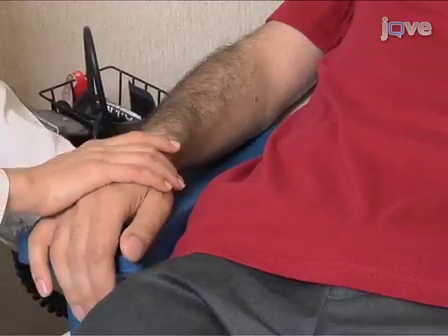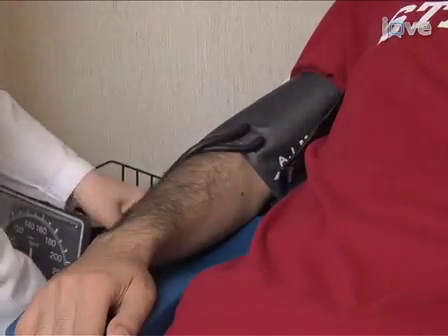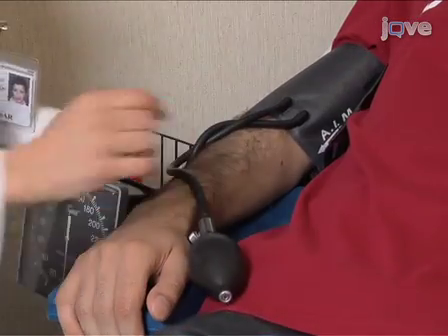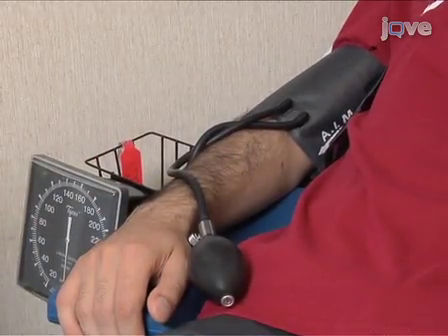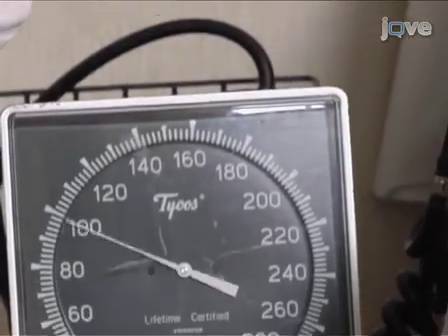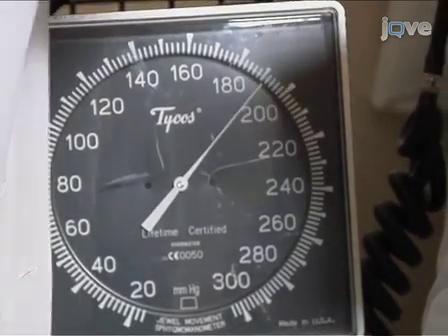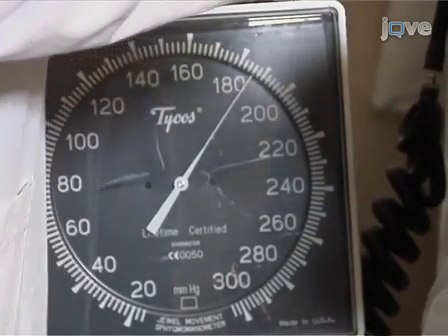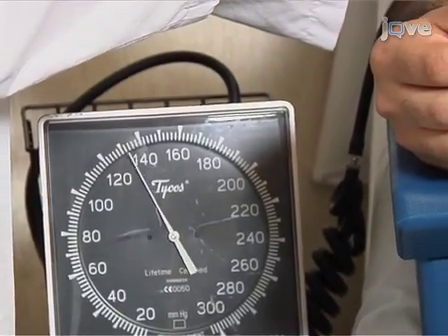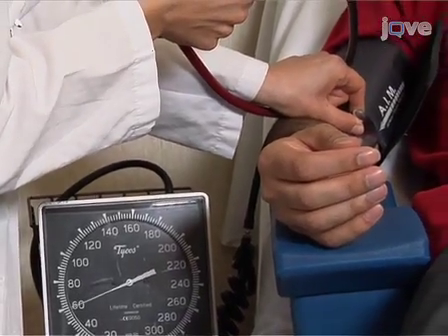Apply a blood pressure cuff to the arm and allow the arm to be supported at the patient's side. To allow the patient to reach cardiovascular steady state, they should be relaxed and comfortable in the supine position for at least 15 minutes. Measure the blood pressure in the arm that is not occluded during the Endo-PAT study. Move the cuff to the non-dominant arm, which will be occluded. It is important to know the blood pressure so that the cuff on the other arm can be inflated to a suprasystolic pressure during the arterial occlusion phase of the study.